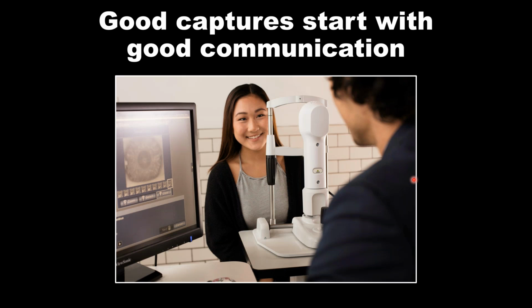And that's especially important when we're dealing with children and we're doing pre-fitting maps in orthokeratology. Often the kids can be as young as 6 years old, 7, 8. And the research that came out of Hong Kong Poly showed us that younger patients tend to have less accurate topographies, because they're moving around, they're fidgety, they don't like us bringing this instrument toward them. So communicate clearly that all this instrument does is take a photo. Generally, they're quiet for that capture.